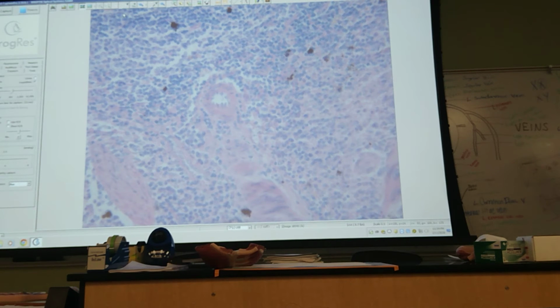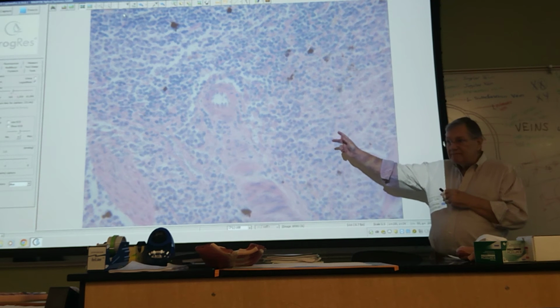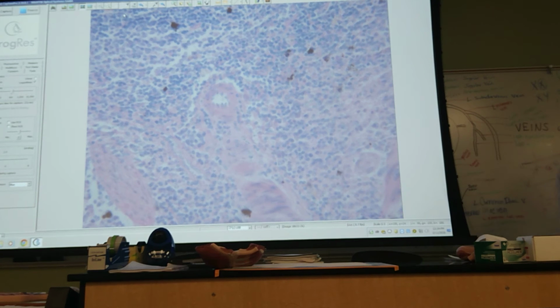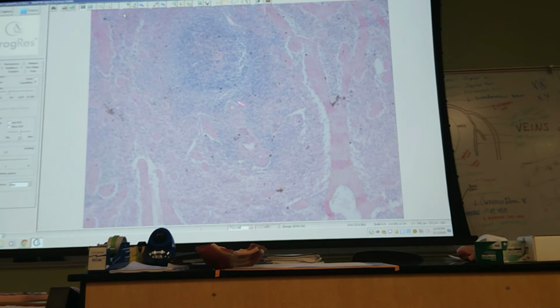Okay, take that picture. You all have photographic memories, right? Yes, of course. Okay, so take that little picture. Okay, file it away because we'll tell you why in a minute. All right, now, back to the last part. We told you your spleen did 2 things. So this is the defense part. These splenic nodules, there he is. Right there, central artery. It's just on the outer edge in this case. And again, it is not a trabecula.